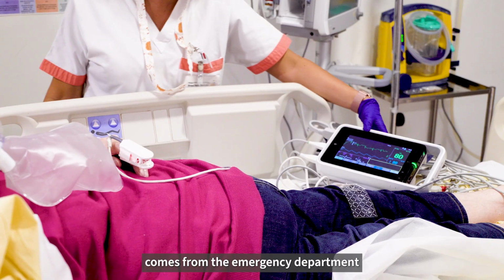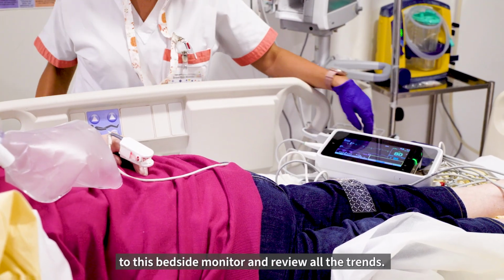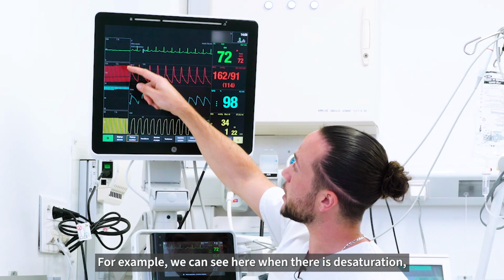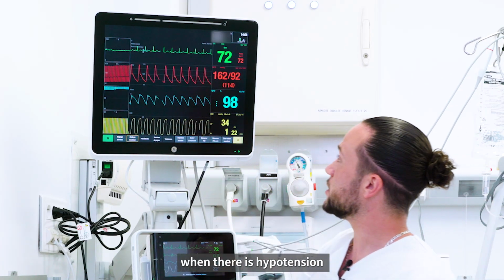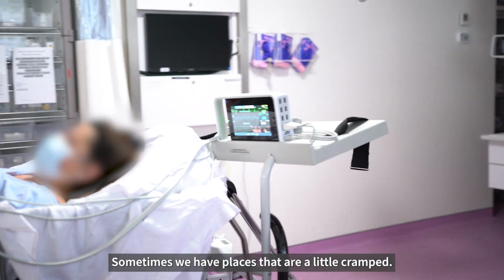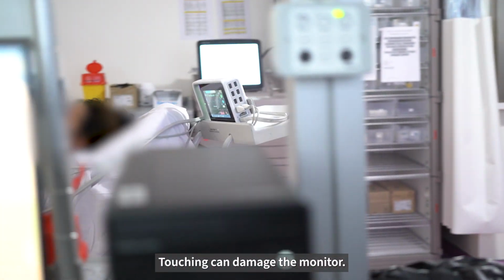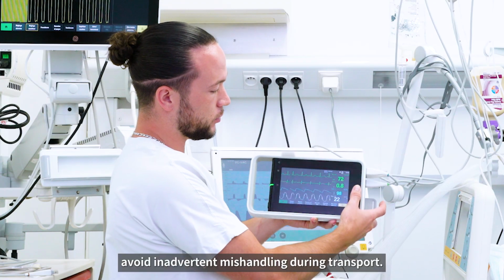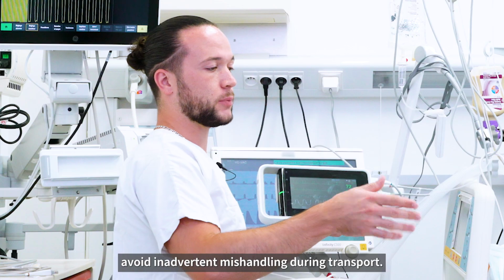We are able to connect the monitor that comes from the emergency department to this bedside monitor and review all the trends. For example, we can see here when there is desaturation, when there is hypertension, and put things in context. Sometimes we can have places that are a little cramped. Touching can damage the monitor. But with this little button, you can lock the screen and avoid inadvertent mishandling during transport.